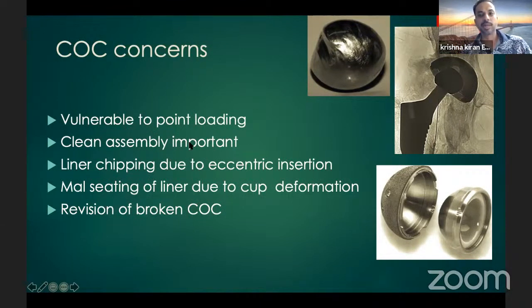Clean assembly is important for ceramic on ceramic bearings. Whenever you insert the liner, you have two different types of tapers, the 10 degree and 18 degree. You must know which taper you're using. Some of the ceramic inserts are more difficult to insert, and it is prone to eccentric seating, which can lead to the ceramic liner fracture if you're not careful intraoperatively.